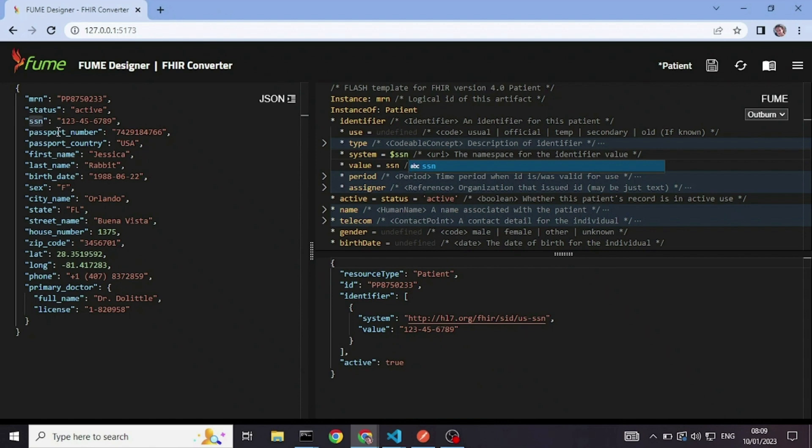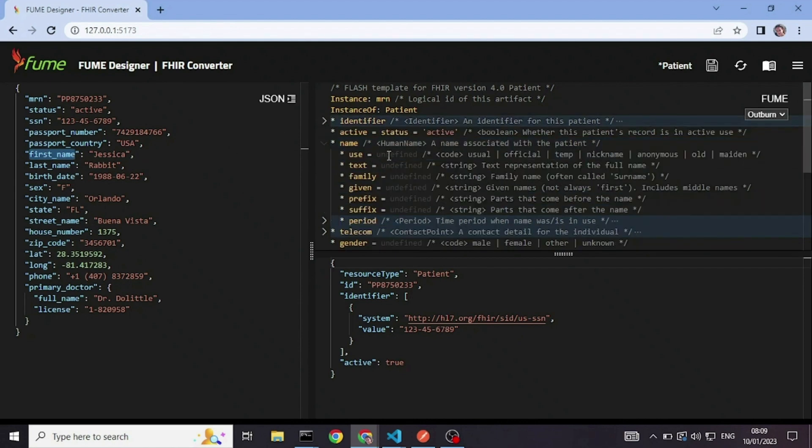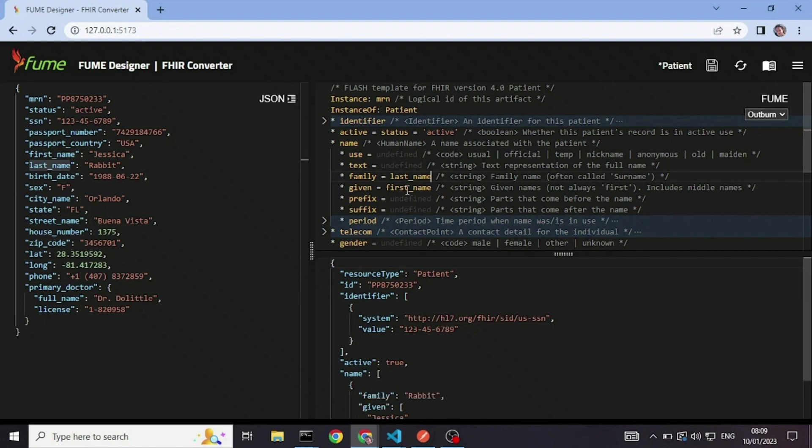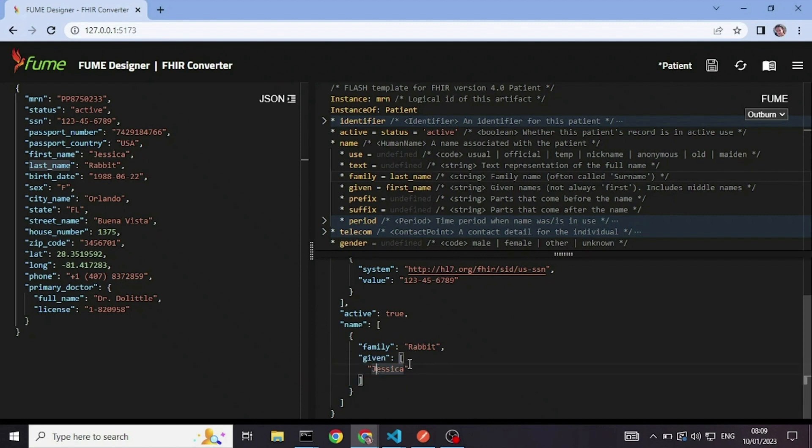Next will be the first name, which is going into name given and the last name, which goes to family. As you can see, you don't need to worry about which element is a repeating element. Fume does it for you.